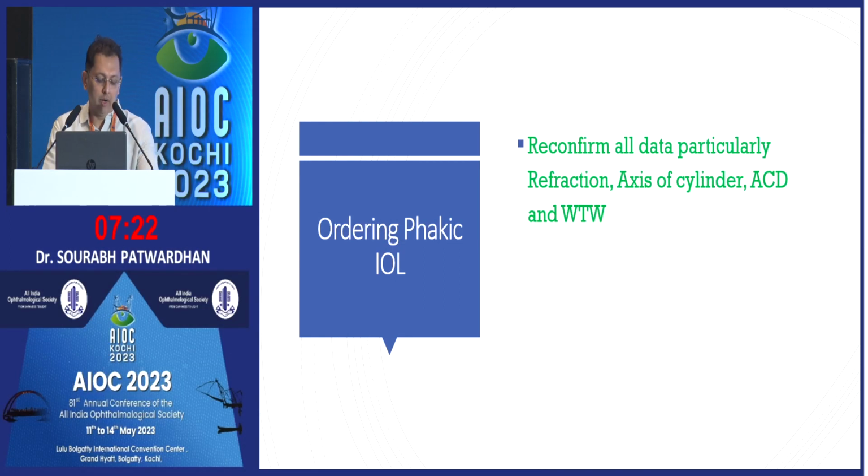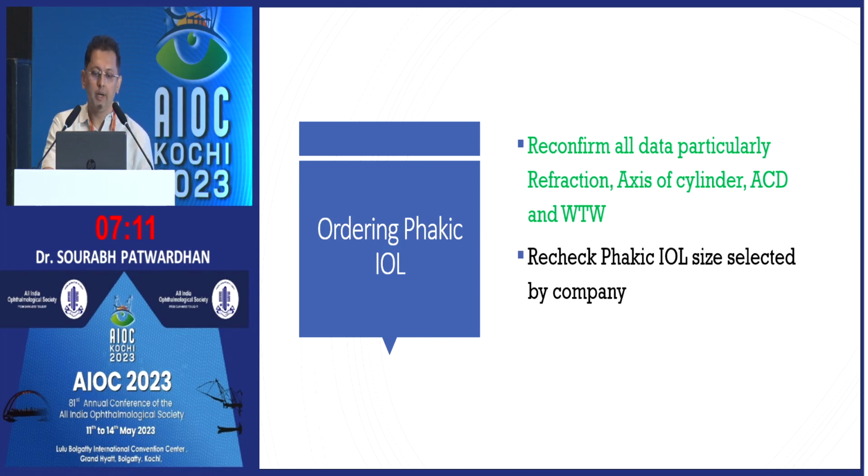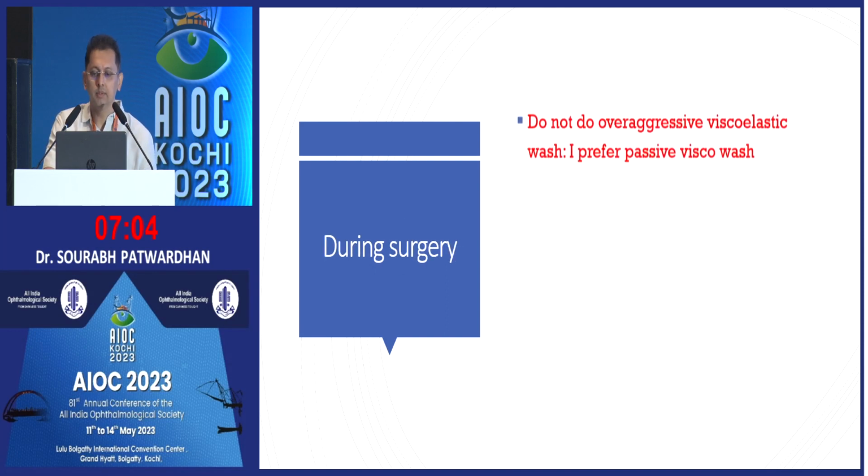Now, before ordering the phakic, most important is to reconfirm all the data, including the refraction, axis of cylinder, ACD, and white to white yourself before ordering, and recheck the phakic which is selected by the company. Double check. This avoids many problems in the post-operative period.